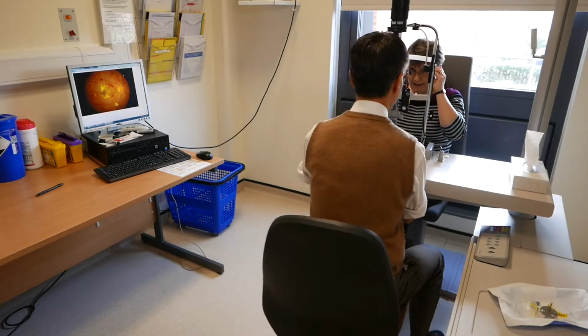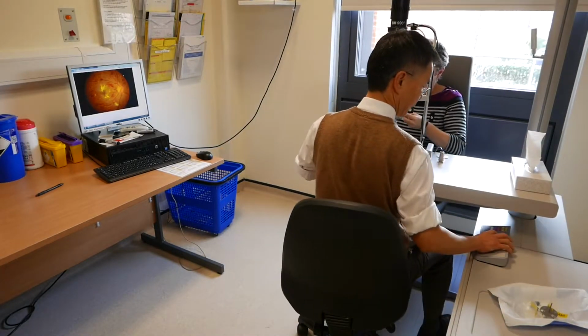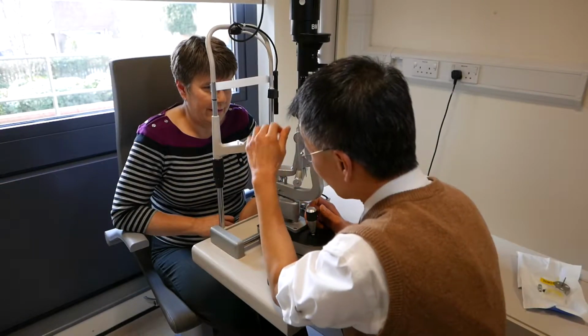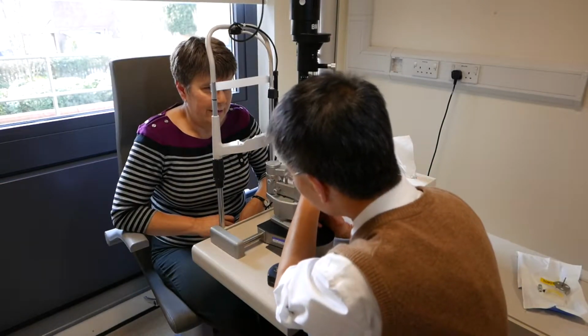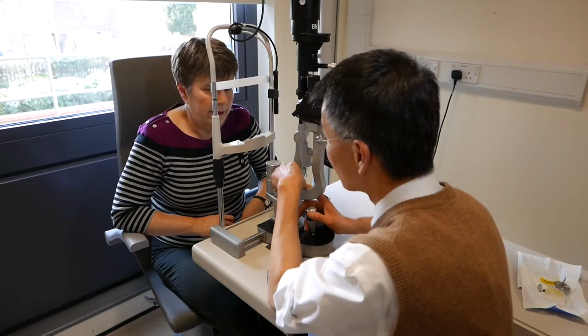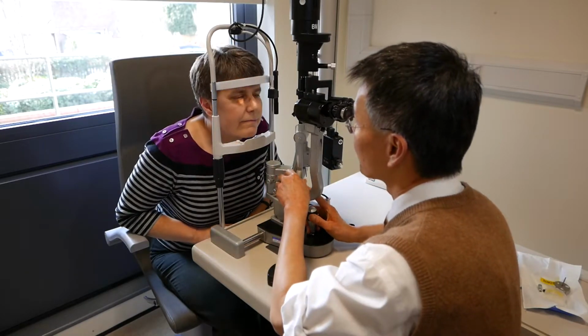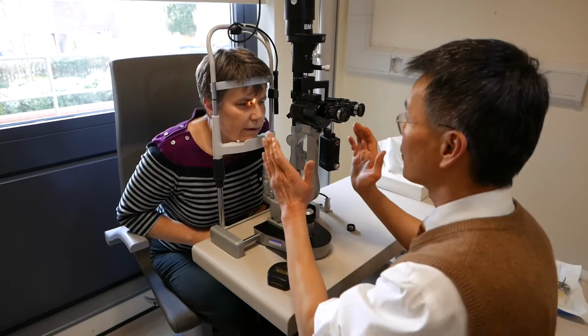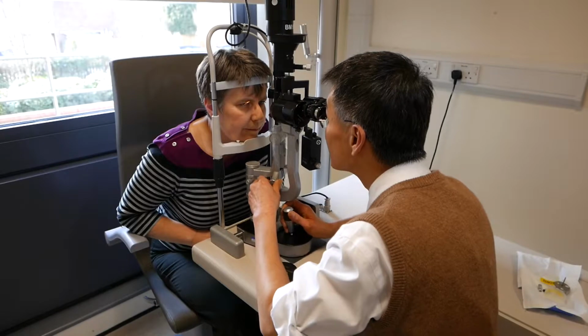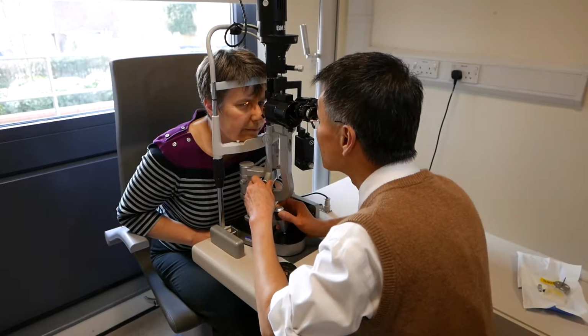Specs off, obviously. This will not hurt. All I'm going to do is have a look at you with this machine. It will shine a bright light into your eyes, but that's all there is to it. You can put your chin on here, and if I can get you to just look straight ahead to begin with. Just a bright light coming on.